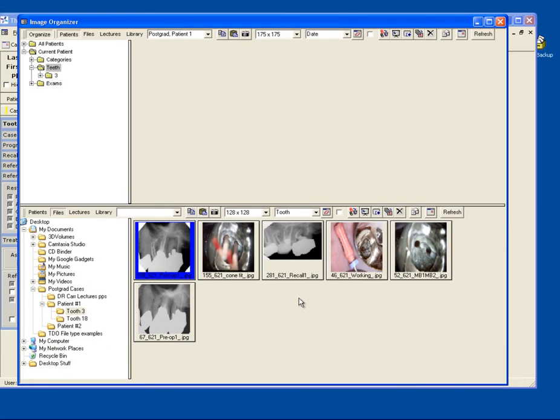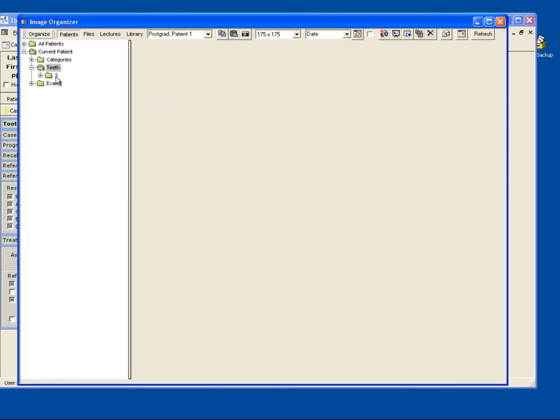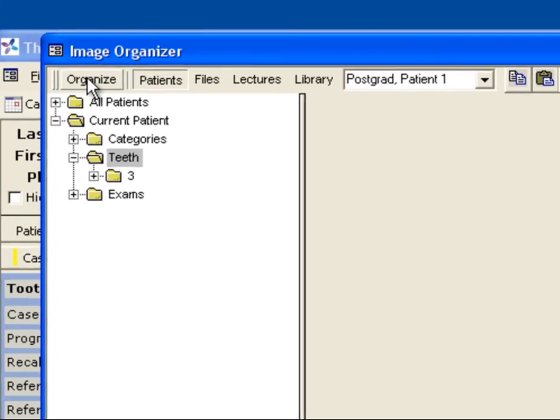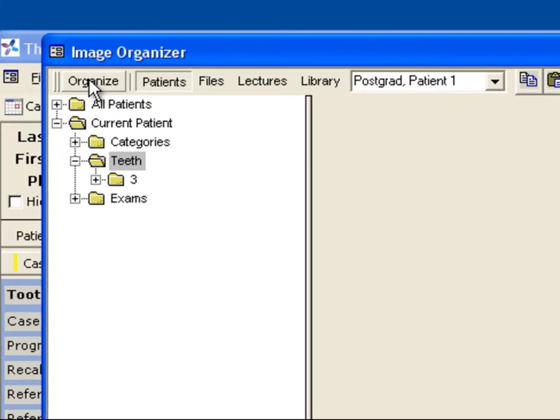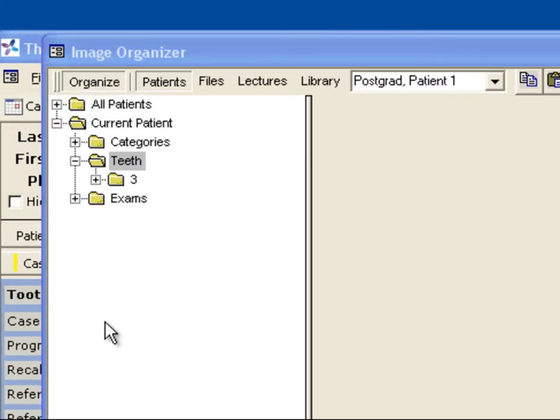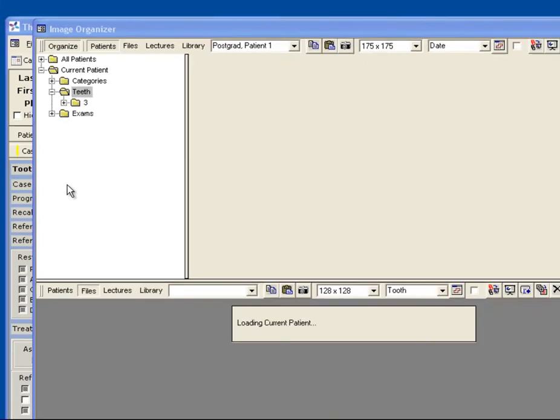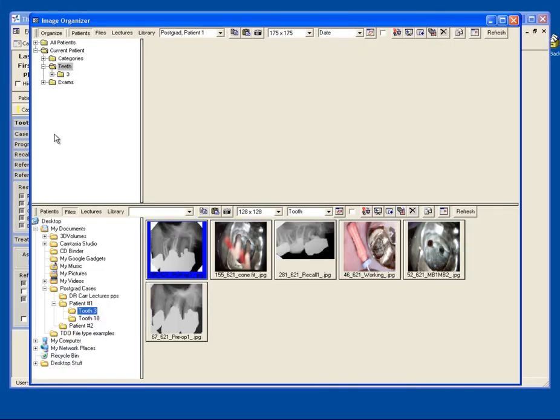I like viewing the page in the organized format, which means you have two separate panes of information. If you do not see two separate panes, simply click the organized button on the upper left hand corner, and that will add your second pane.